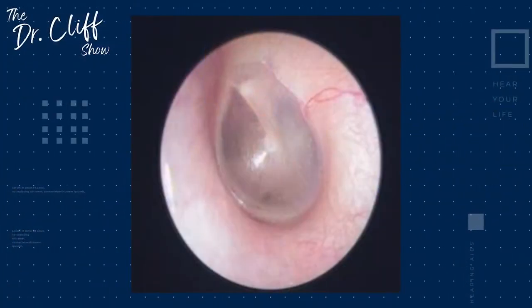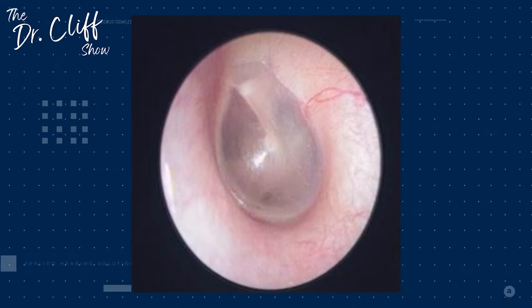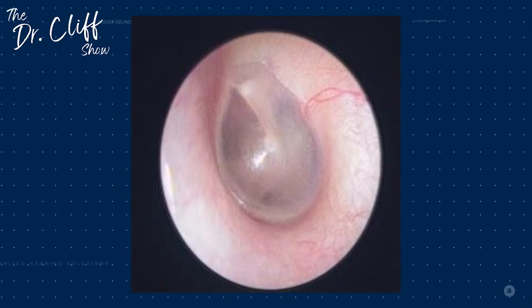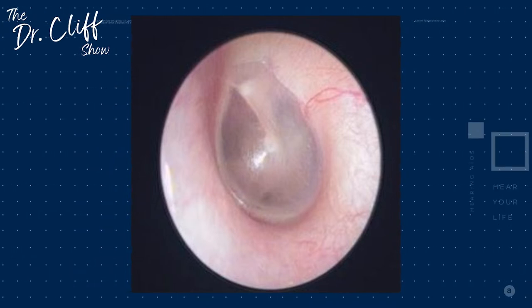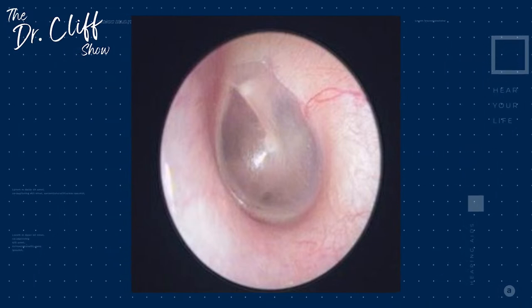So like I said, let's play nice. Let's show them a normal ear canal. Right. With a normal eardrum. Yeah. So what are we looking at right now? So what we're looking at right now, I would say that otoscope is pretty far into the canal. And what we're really visualizing in the center there, you can kind of see the ring around the perimeter. That is your eardrum, also referred to as your tympanic membrane.